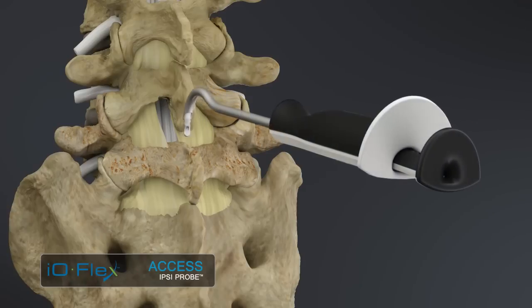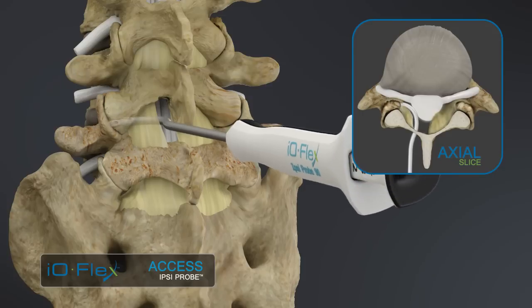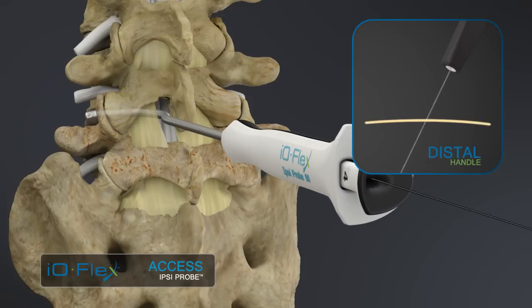During the access phase, an interlaminar window is created and the IOFlex probe is inserted and deployed out the foramen. The guide wire is passed through the probe and advanced until it exits the skin, where it is captured in the distal handle.